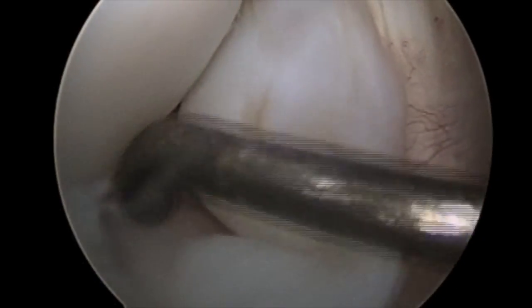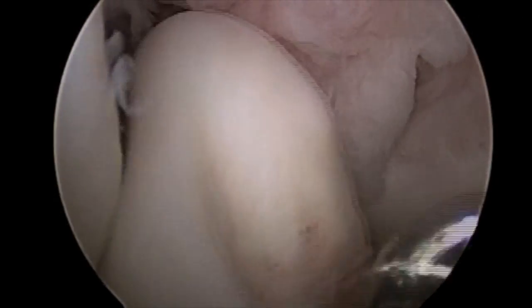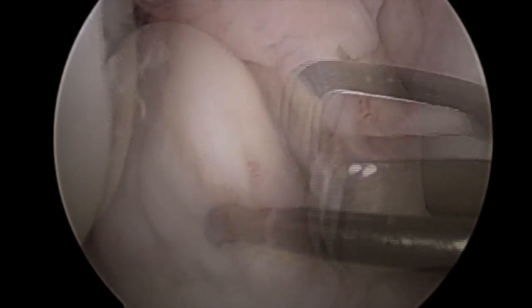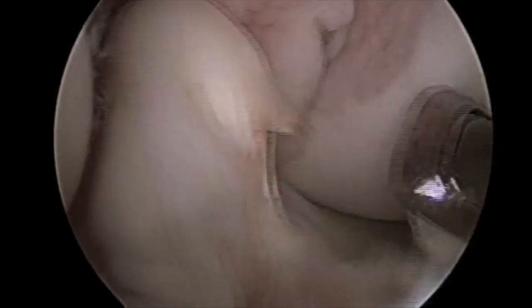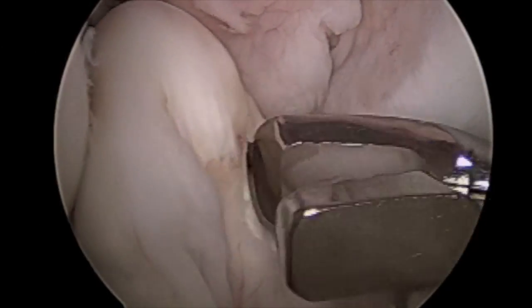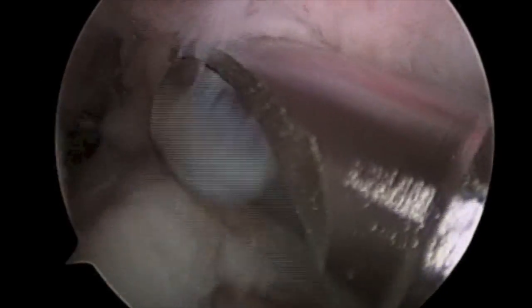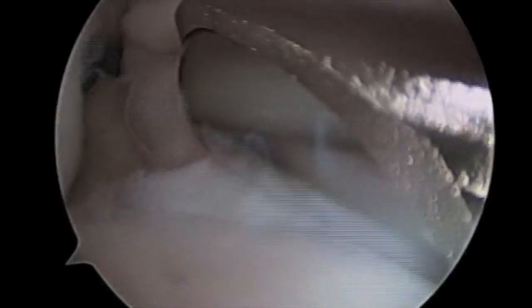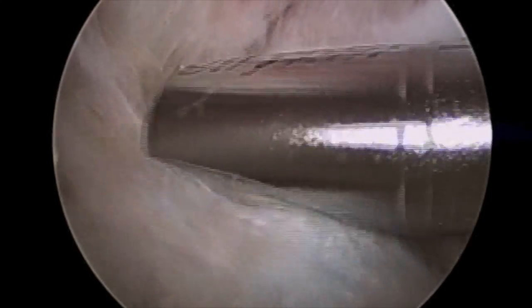Examination of the notch demonstrates a complete tear of the anterior cruciate ligament with a proximal rupture. An arthroscopic biter is introduced into the knee and utilized to resect the remaining anterior cruciate ligament stump. An arthroscopic shaver is also utilized to resect the remaining ACL stump to assist with footprint visualization and future tunnel placement.